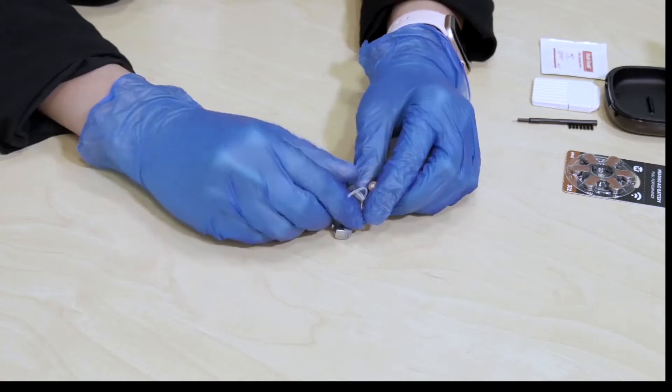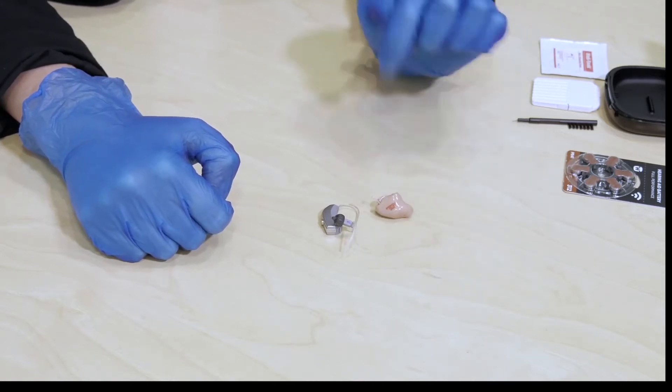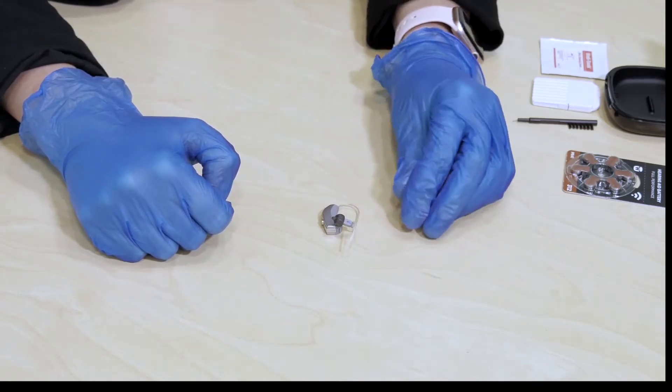A couple of things to troubleshoot if the hearing aid's not working. First thing to do would be to try and put a new battery in. So I'm just going to do it with the two main types of hearing aids that we have. One is this type that sits behind the ear and one is the more custom one that sits completely inside the ear.